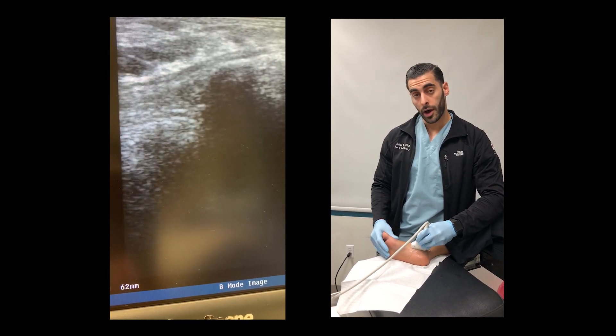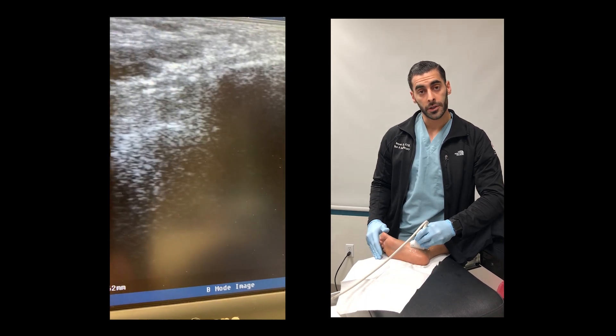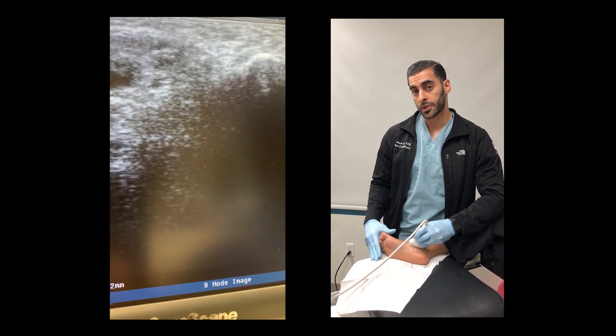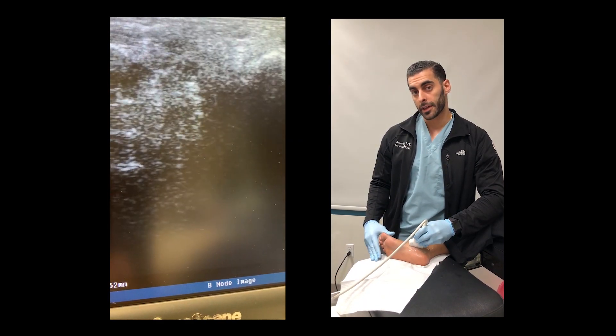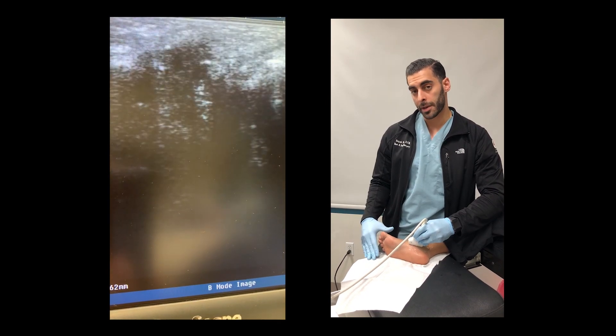I'll show you guys some images with some pathology to help you when you use ultrasound to identify these bits of anatomy.